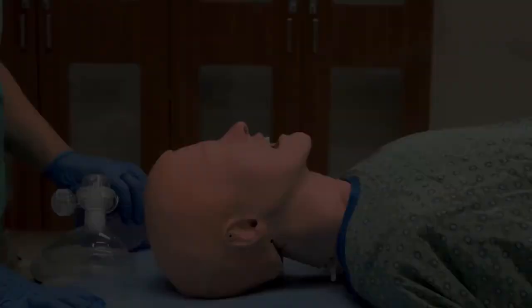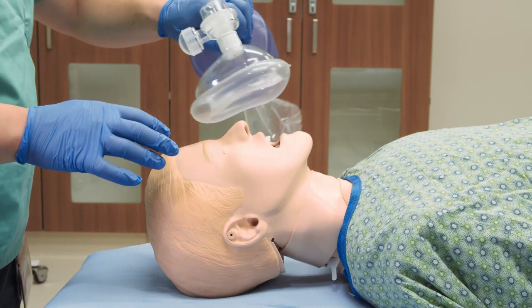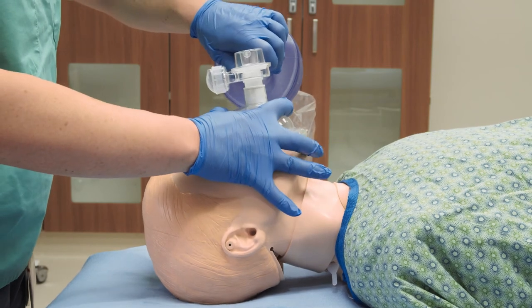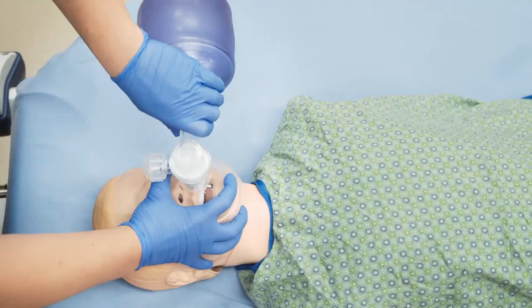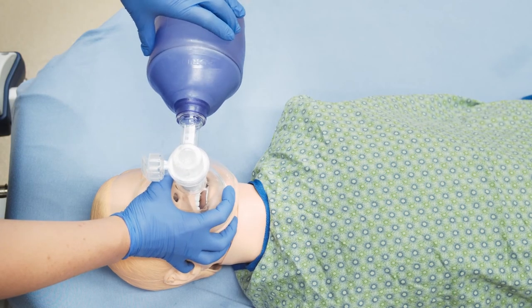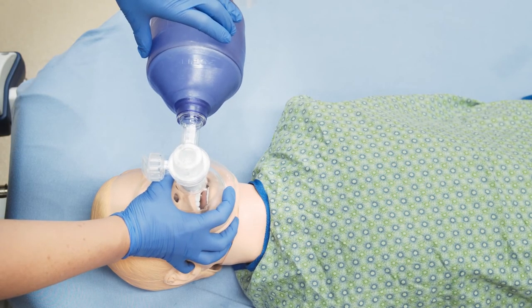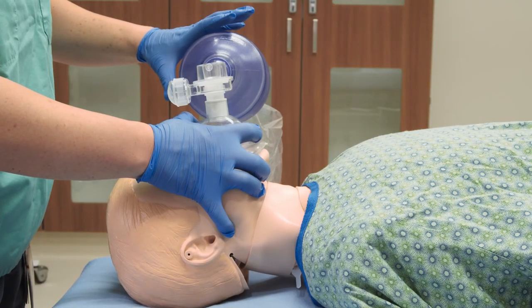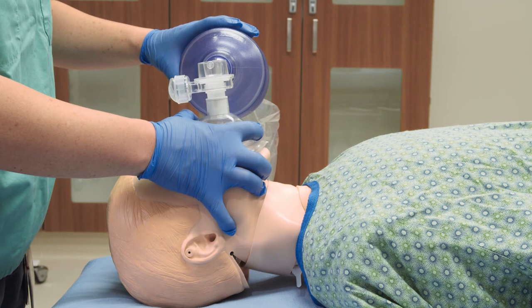Place the mask over the patient's mouth and nose. Put your hand in the EC position: your thumb and first finger should make a C around the top of the mask and push down evenly. Your last three fingers should reach just under the bony part of the jaw, looking like an E, and pull the jaw upward to open the airway.